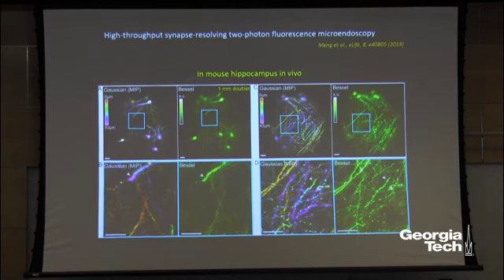So what we found is that we can generate those Bessel scanning even through those GRIN lenses at a very high resolution. So here is just some in vivo example where we're looking at a mouse hippocampus. And on the left-hand side, again, are the Gaussian images where the structures are color-coded by depth, which I should have mentioned for my previous slides as well. And with the Bessel beam, we can basically, instead of having to take 15 images to cover this volume, only need to take one image, and we can see all those neuron cell bodies very easily in the single scan. And when we zoom in and look at the neuronal processes, what you can also see is that we can see axons, axonal boutons, dendrites, and dendritic spines.